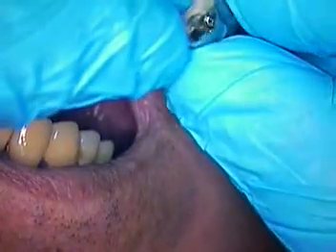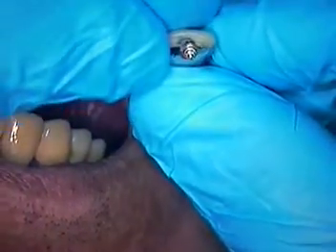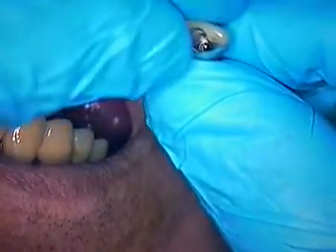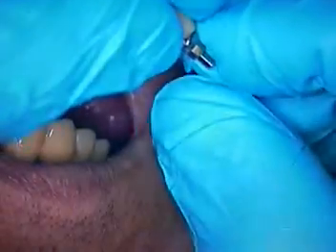We did have to drill an access hole in the back of the crown, place a new screw to make sure it seats passively within the crown and the abutment itself with new pristine threads.